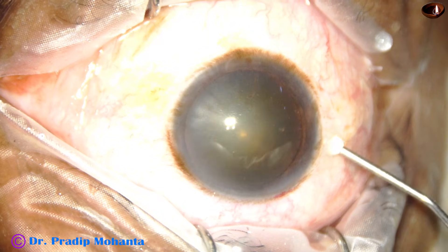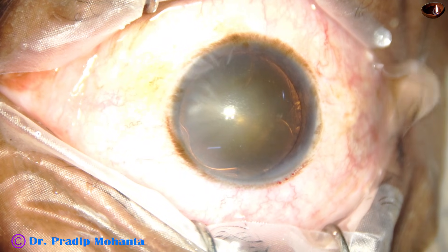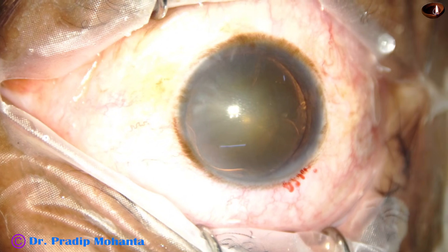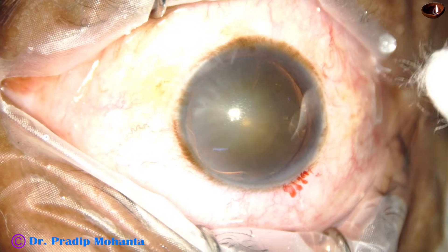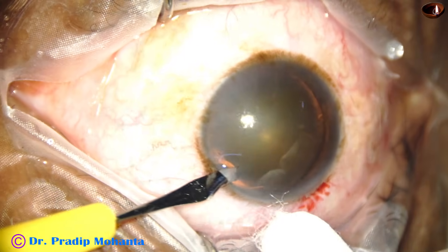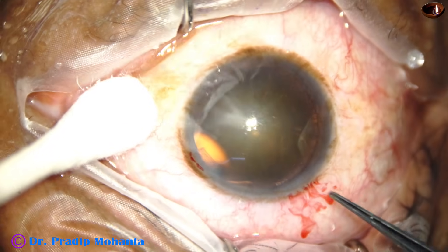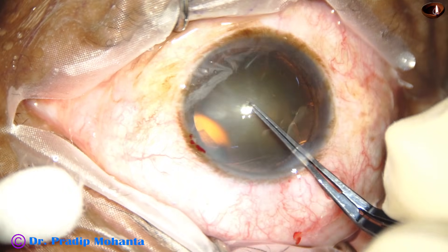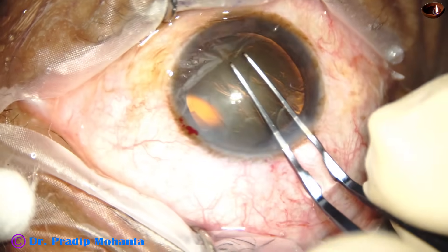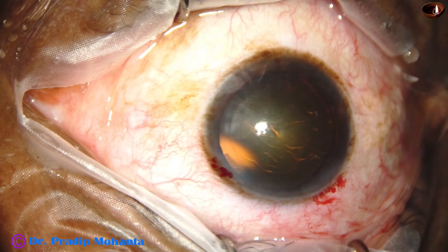In this case, the main incision has been done. The anterior chamber is filled up with viscoelastic. A side port is made on the left side of the main wound. I make only one side port, and the side port is about 1.6 to 1.8 millimeters. And now the capsulorhexis is being done with a Utrata forceps.